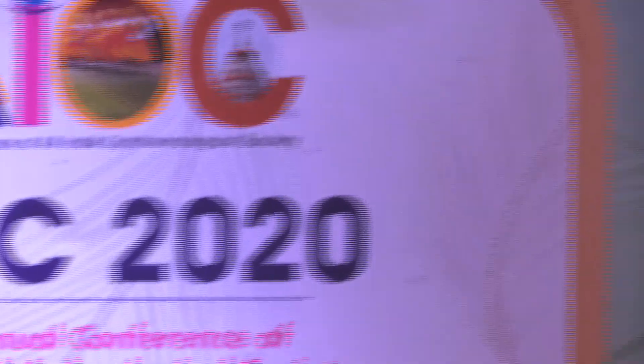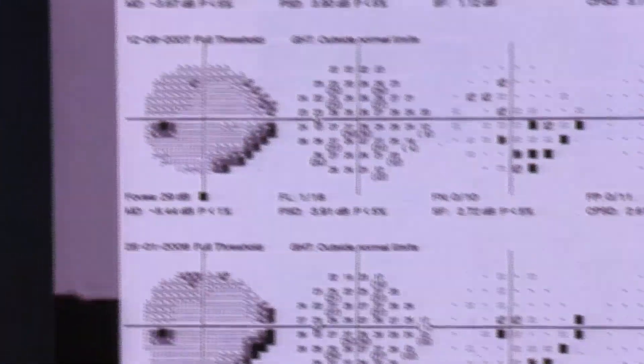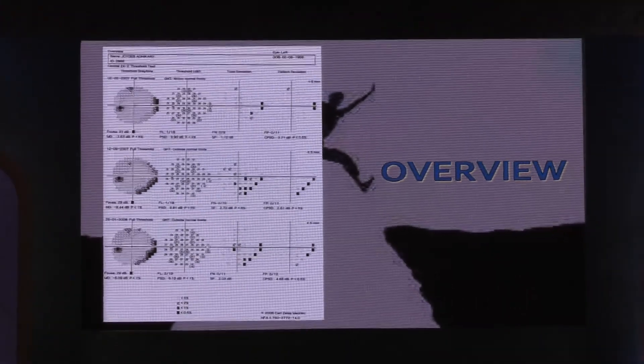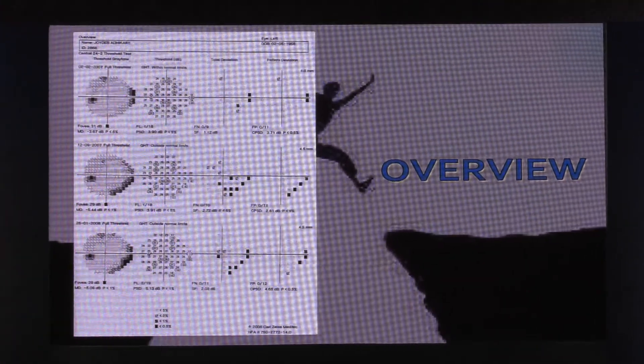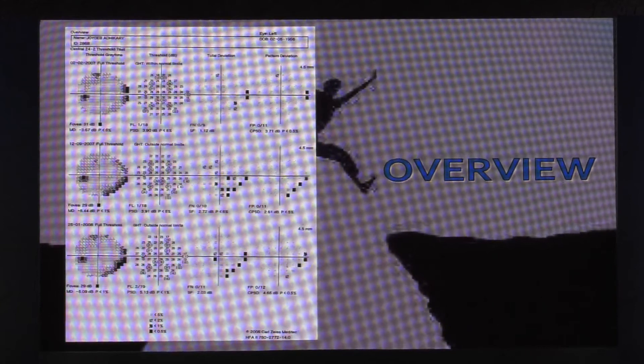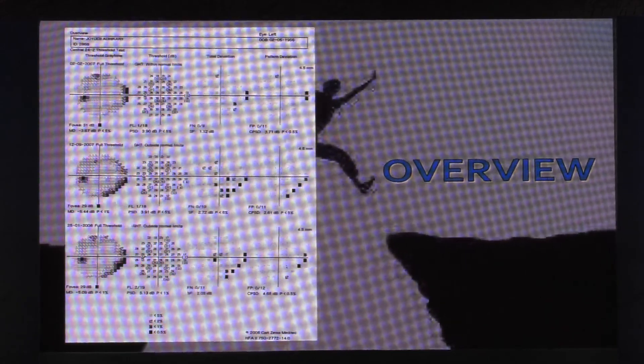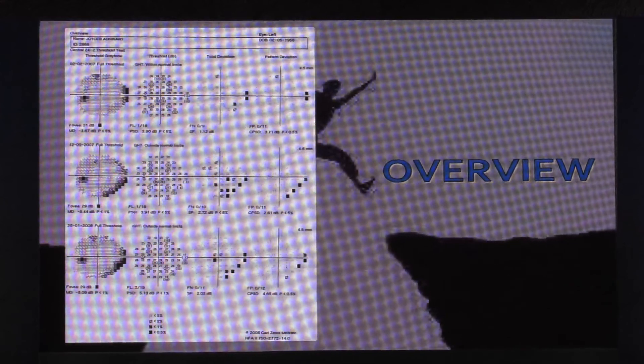To go through the overview in the Humphrey, if you look at those subsequent tests that were done six months apart or eight months apart, you actually see that the patient has progressed. Look at the PSD out there, 3.90, and then that's gone higher. I don't know whether it's very clear for you to see, but that is the overview that you see in the Humphrey.